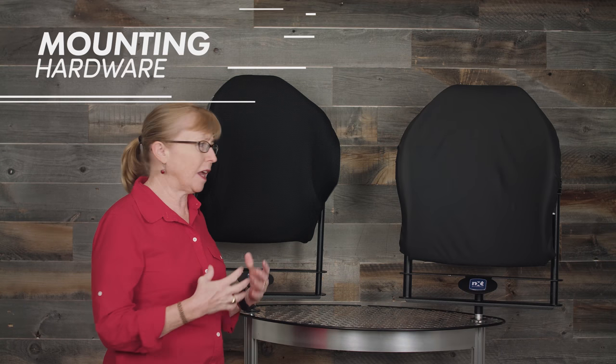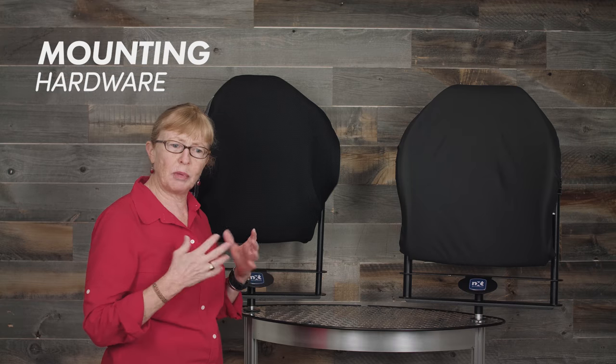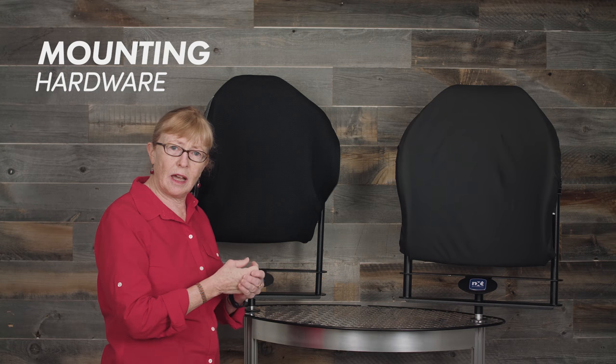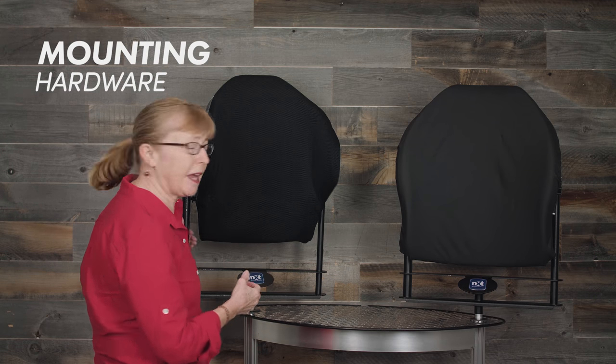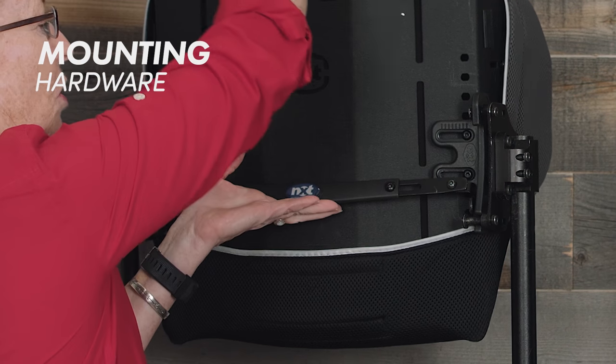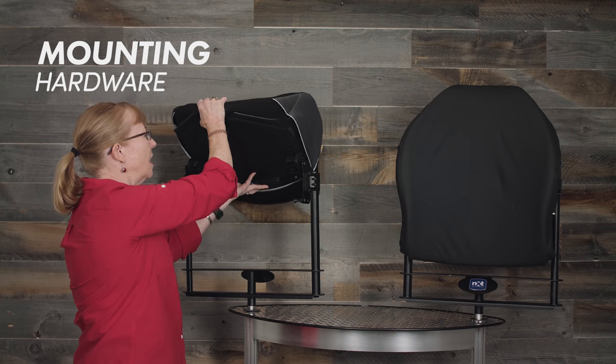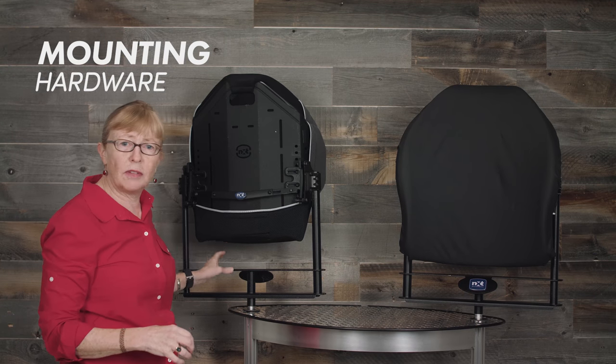An important feature of any back support is how it is removed and put back onto the chair. Often, particularly with folding manual chairs, people do not get a rigid back because the effort to take it on and off is quite challenging. With the Xtend series we have what's called a one-handed release — I simply lift, push forward, and the back comes off the wheelchair, then I can snap it back on very easily.